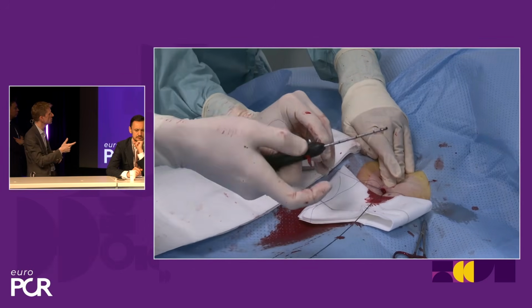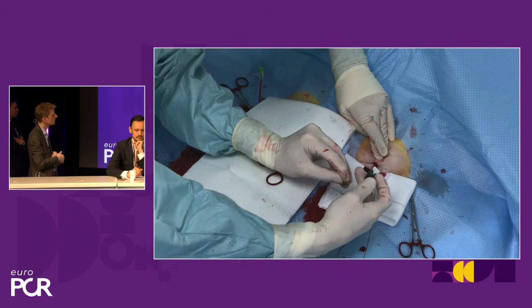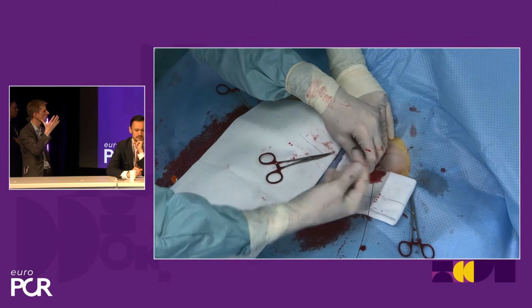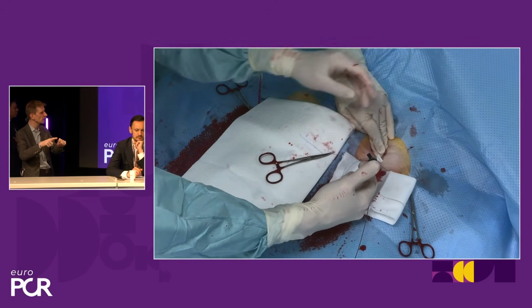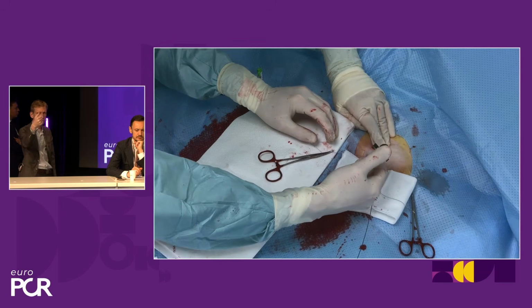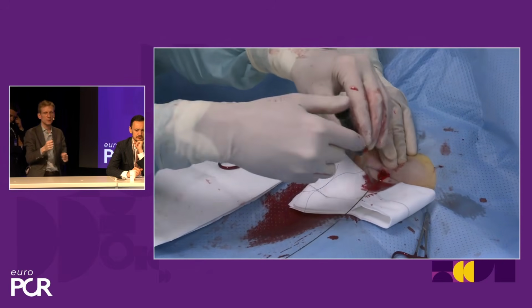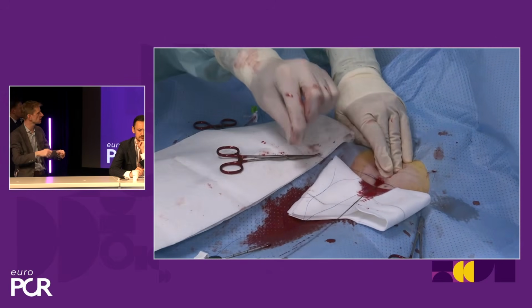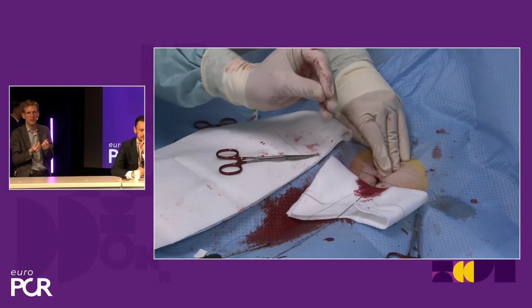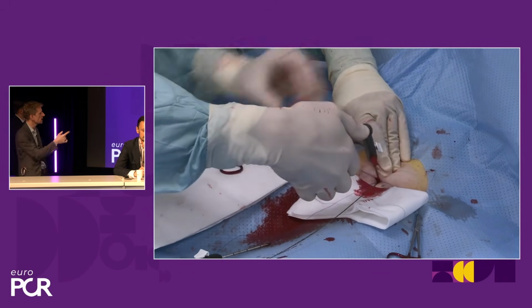Now I take the pusher. I let it slide down, and then it's important that you do this as an act with one hand. So you wrap the suture around your digit finger, and then you push with your thumb. You do this best with one hand. You learn this. I see people also doing this with two hands, pushing and pulling on one. I don't like it that much because you don't have the same tactile feedback and finesse in the pushing. So it's better to do this.